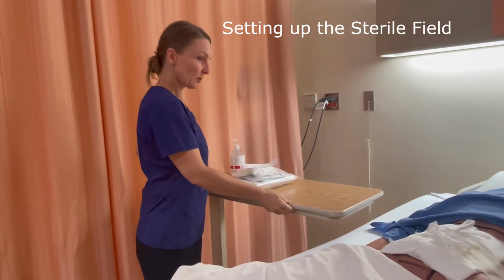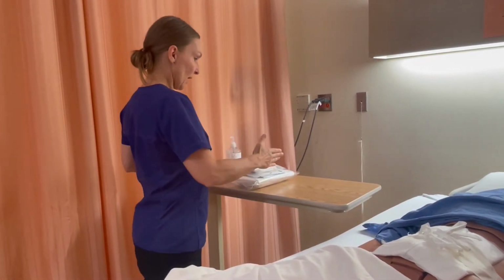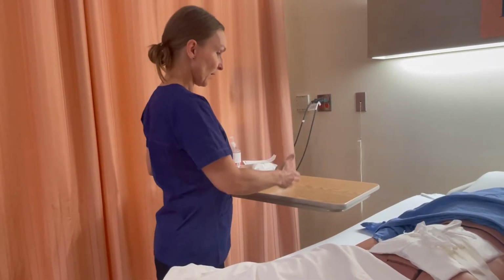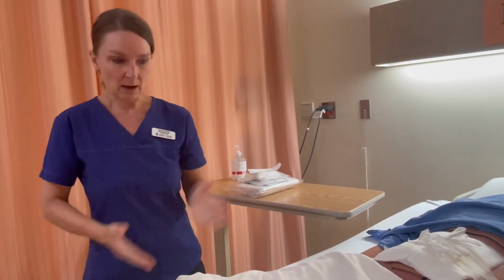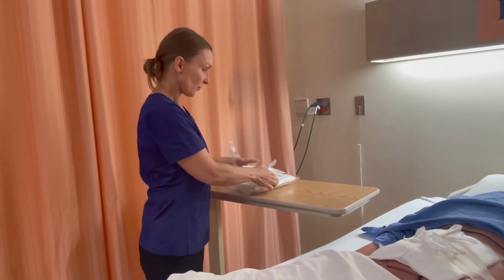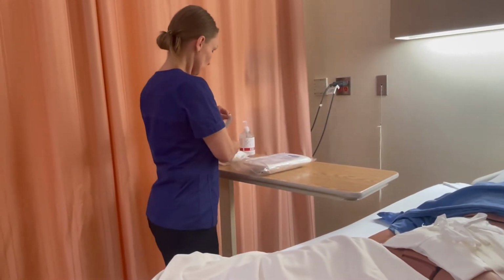First and foremost, I want to have the patient at waist level, and I want to have my bedside table also in such a position that I can easily access my patient. And later when I need to put on my sterile gloves, I am good to go. I don't have to put them on up at the head of the bed. So I'm going to start by opening up my wound care kit and adding supplies.